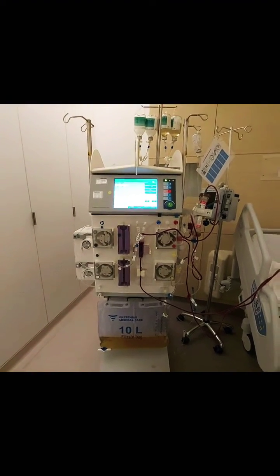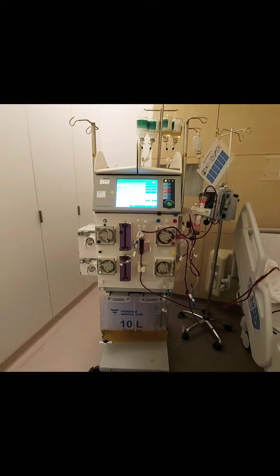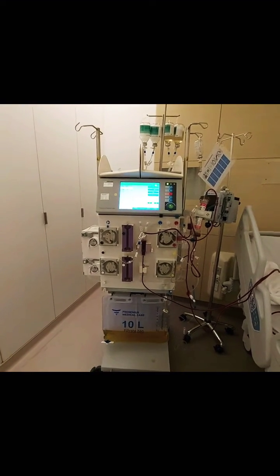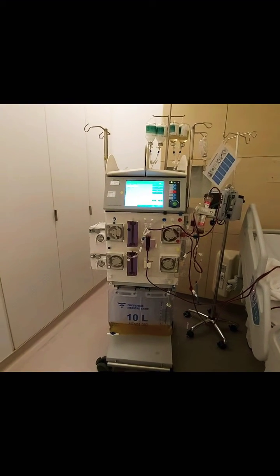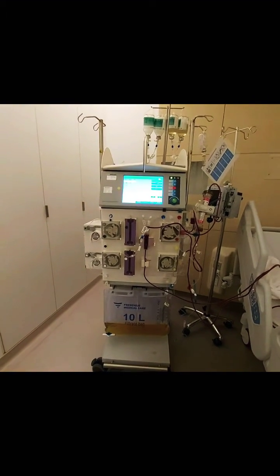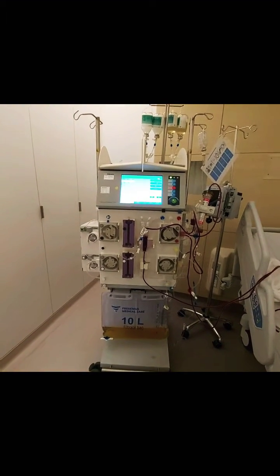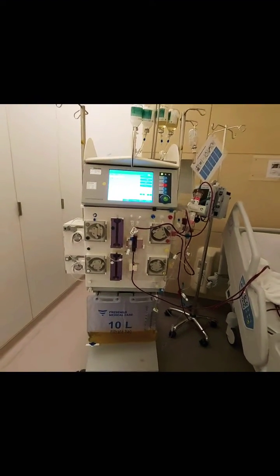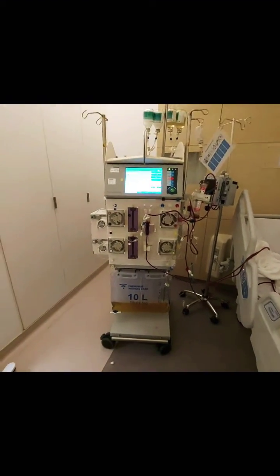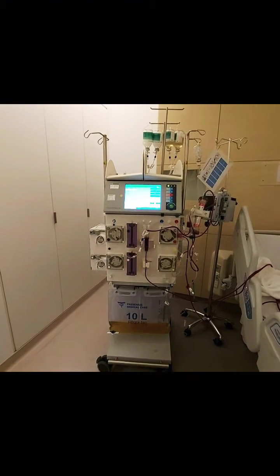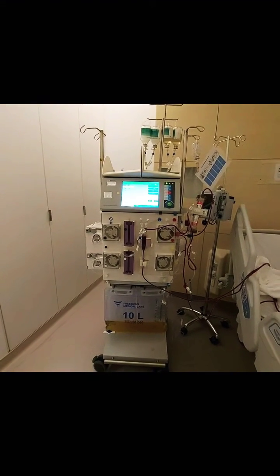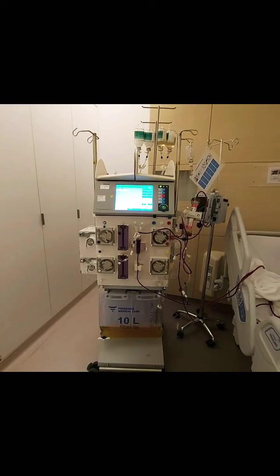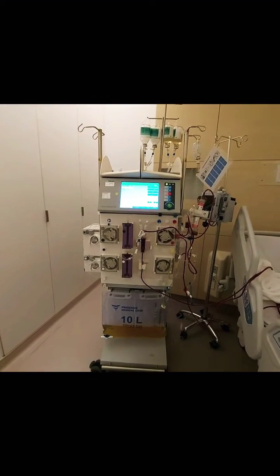Hello everyone. This video is to give you a brief insight of how plasma exchange — membrane plasma exchange — is performed using the Multifiltrate Fresenius machine. The Multifiltrate Fresenius machine can perform several modalities of RRT, and plasma exchange is one of the therapies which can be done for the patient both in the ICU as well as at the bedside.